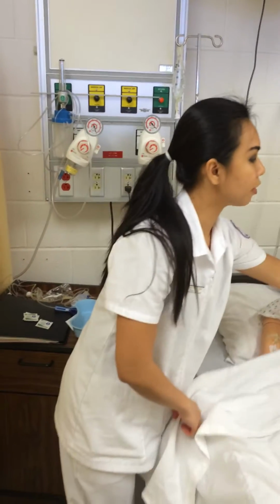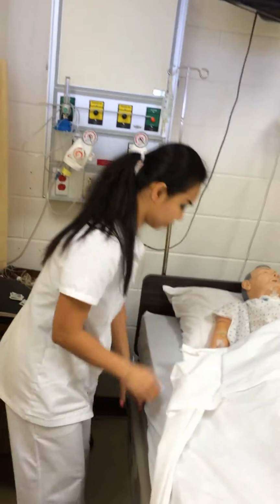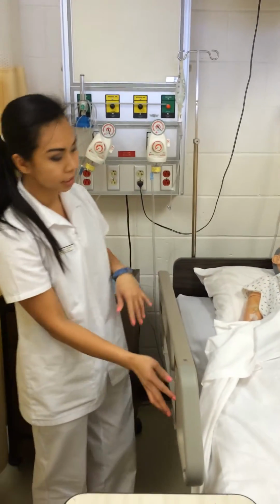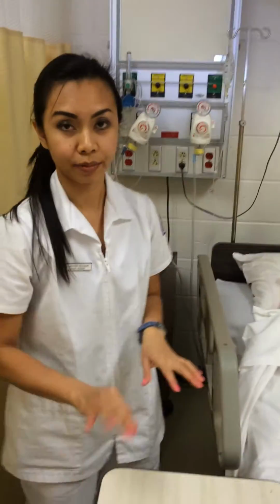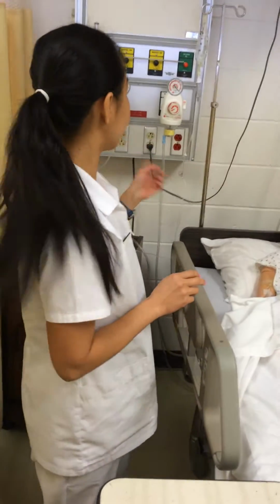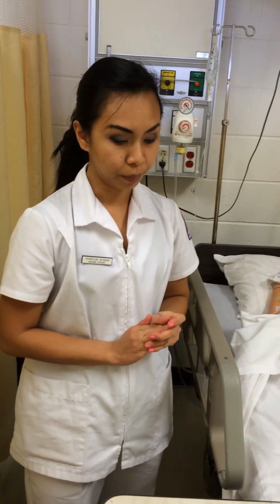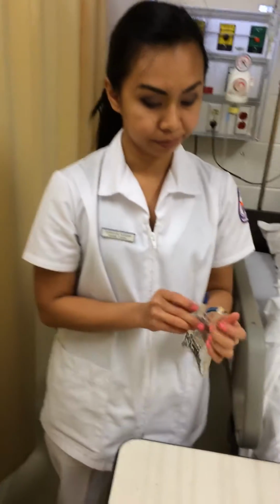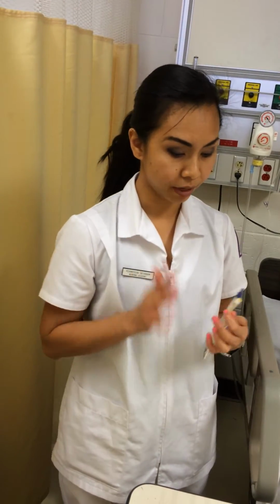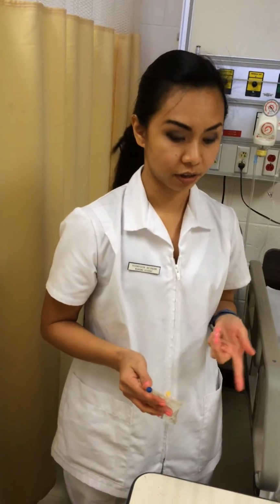Before I leave, I make sure the patient is comfortable, bed rail up, and the bed in the lower position, and I document it. After that, I find out that the physician wants to add medicine for the patient for the IV piggyback. So I'm going to begin with 7 steps. First, I have to make sure it's the right patient, right dose, right drug, right time, right route, right reason, and I document.